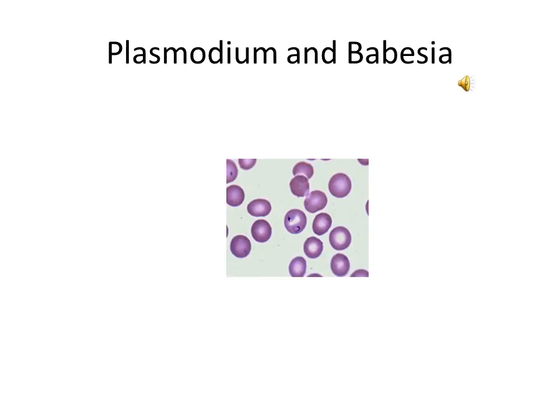Protozoan inclusions are important to make note of, as seeing them on a blood smear is confirmation of infection by the organism. In this slide, you're looking at Plasmodium, malaria. Babesia microti is also an organism that invades red cells. It's transmitted by tick bites. Malaria is transmitted by mosquitoes.